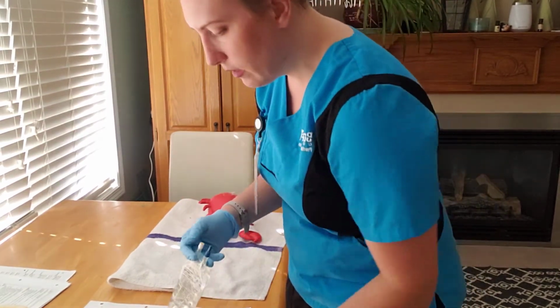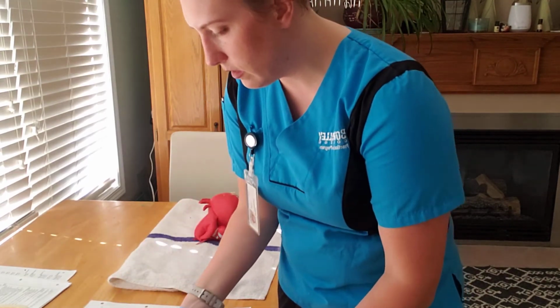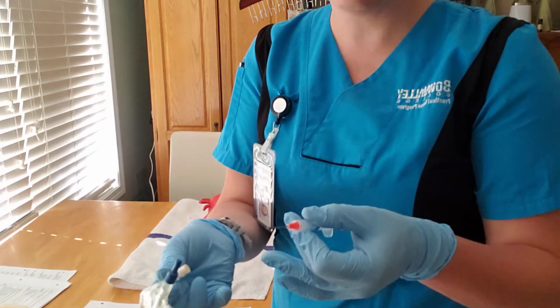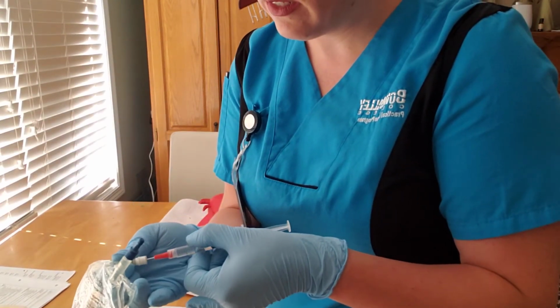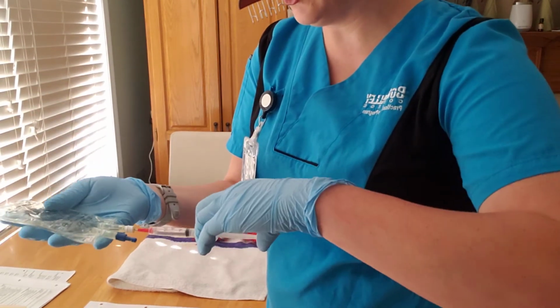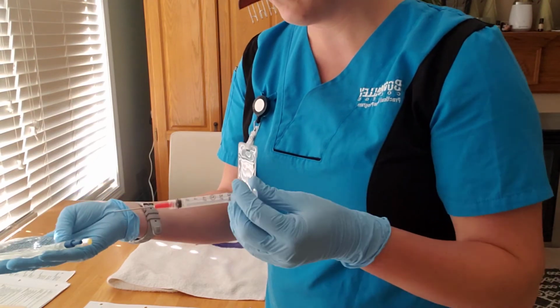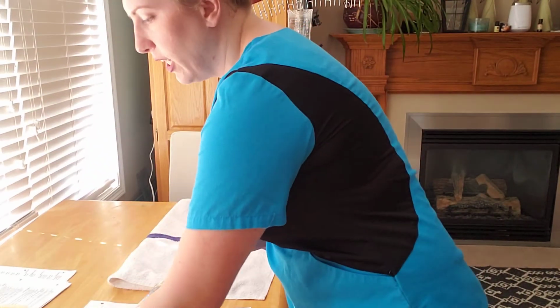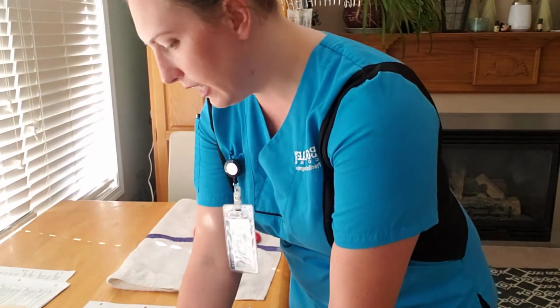Okay. I don't know if you can see. I'll hold it nice and close. There we go. I'm going to inject 2 mils of ranitidine into my saline. Right away, I'm going to put my needle back in the sharps along with the blunt fill cap. Okay, so my bag is here.